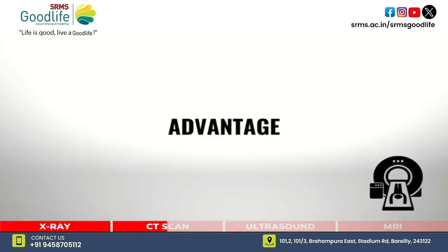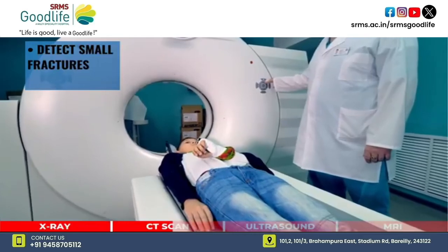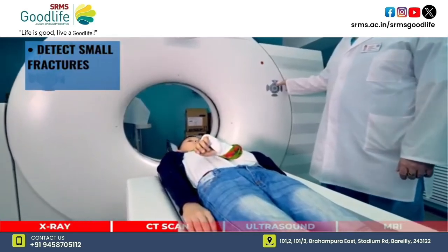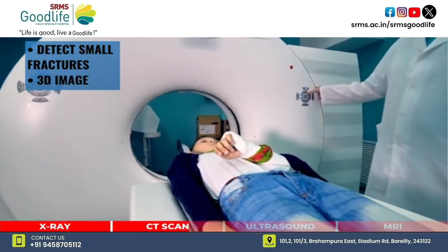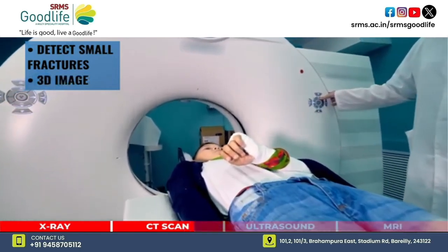CT scan has many benefits. It can detect small fractures that may have been missed on an X-ray. It can also produce a three-dimensional image, which makes it easier to locate the site of injury.